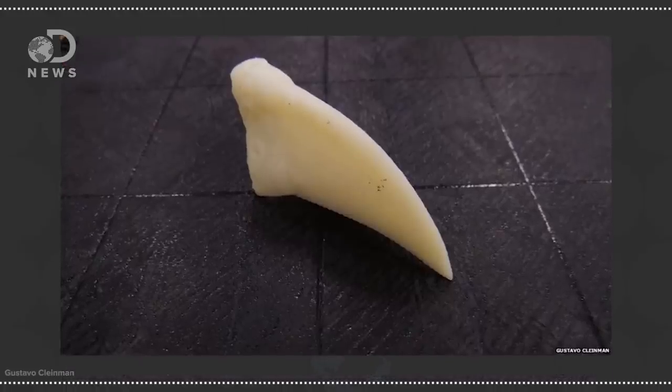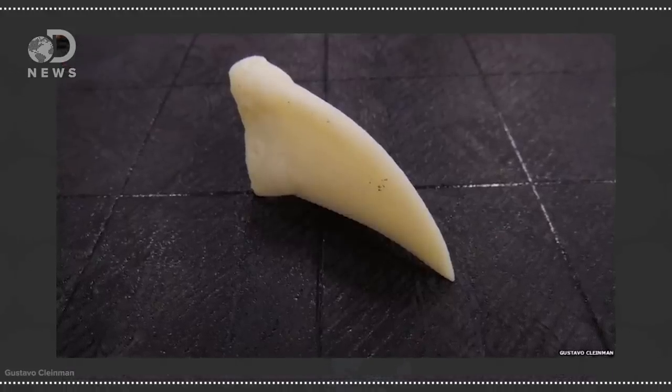It's a light beak, weighing only 4 grams. It's basically a small 3D printed plastic piece that's then covered with nail polish and sealed with a special polymer made from castor oil. She's still unfortunately not fit enough to survive in the wild, but she's a lot better than she was. Now she can eat normally and even use her beak to clean herself.